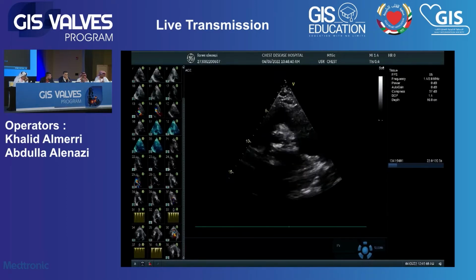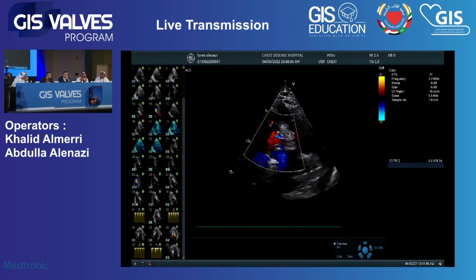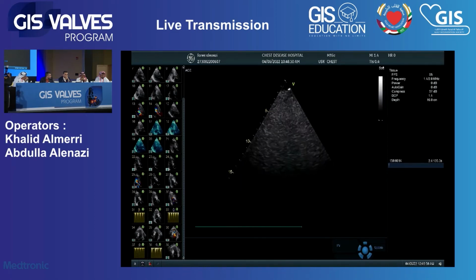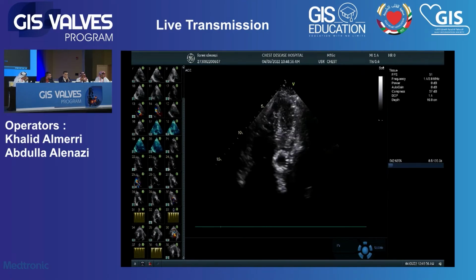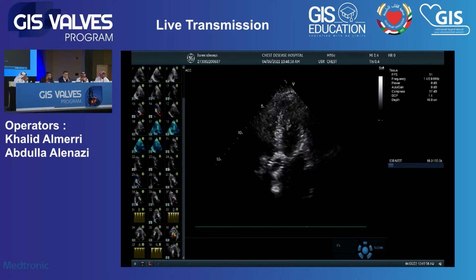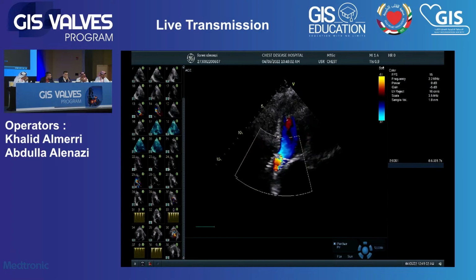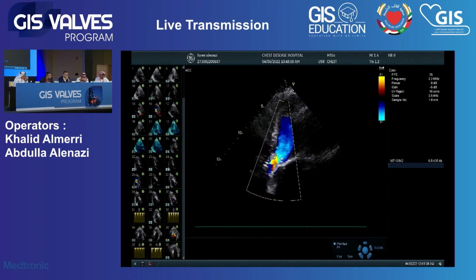Dr. Mohammed? I think the alignment, most of the time, is the same. You go with the port and you follow all the instructions for the same alignment. But I think the consideration is that this is not a normal pathology. It's a bicuspid. And I think the steps they did here, the preparation, the pre-dilatation, and even with the valve in place, in the bicuspid, most of the time you want it to be a little bit higher up than usual.